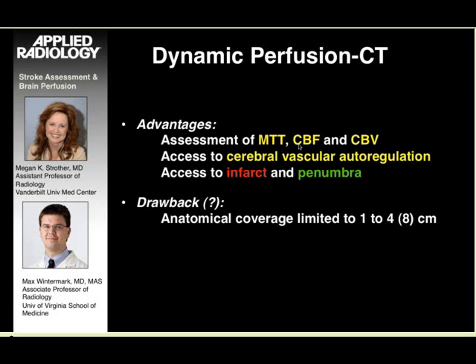The advantage of that technique is that you are going to be able to assess not only the CBV, but also the mean transit time and the cerebral blood flow. And as I'm going to explain in a moment, that's going to help you characterize not only the infarct core, but also the ischemic penumbra, which again is the target of your treatment.